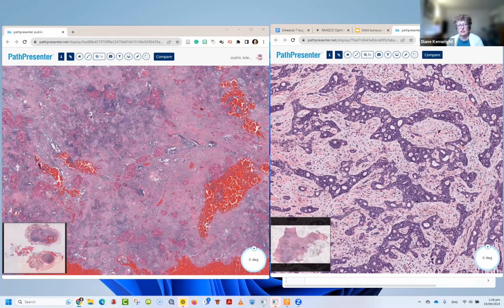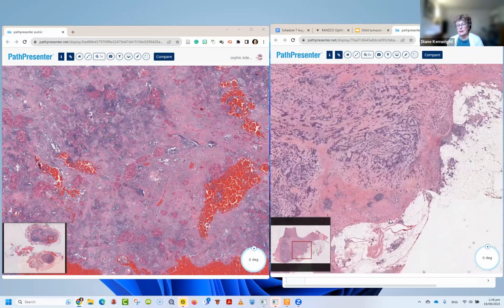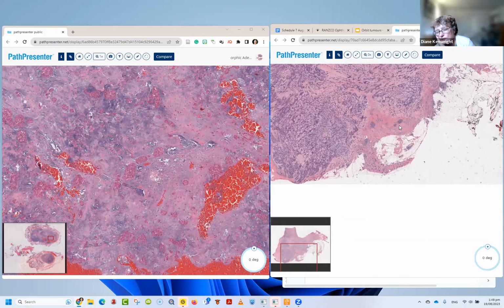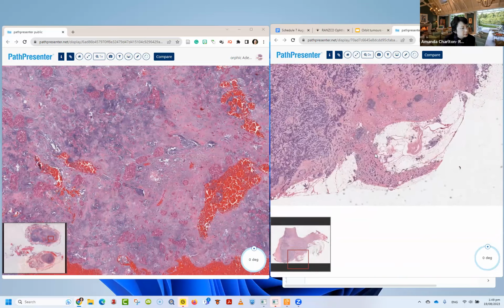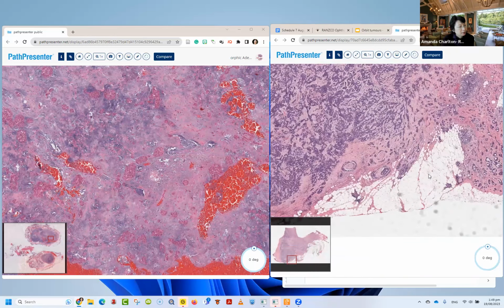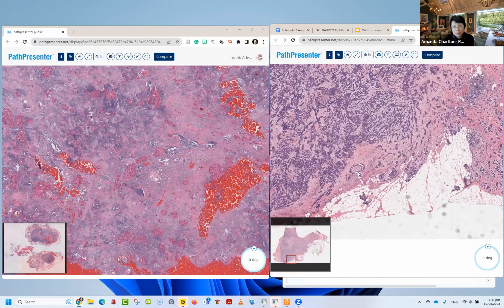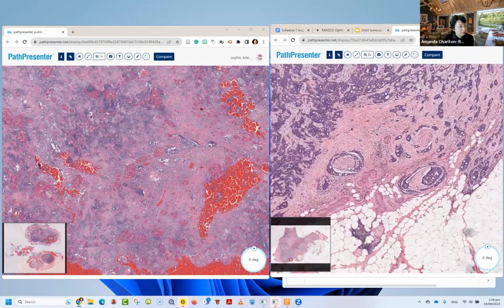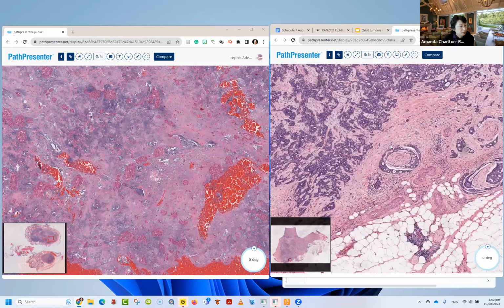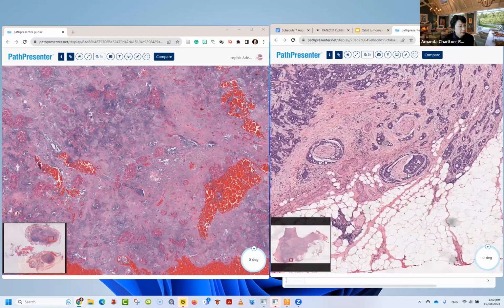Right, so other prognostic features are whether or not the tumor is completely excised and whether or not there is perineural invasion. So I'm going to have a look for nerves. Oh, and also, can you tell us a bit more? Oh, I see some concentric things here. 1, 2, 3. Spot them at low power. And it looks like there's a pink thing in the middle, which looks like a nerve to me. So I'm just going to go a little closer. That's an artery. This is a nerve. See, it's got spindled cells running this way. And that's a perineural invasion. And it's at the advancing edge of the tumor. So I think the next stop for this is the patient.